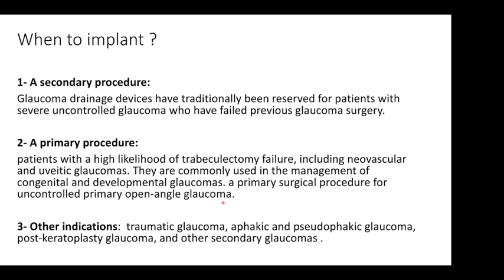And when it comes to the States, quite interestingly, there is a decline in the performance of trabeculectomy, and there is an increase in the performance of valves. So there is a generalized interest in the use of valves, with growing experience in this area, in the management of complications, and better outcomes.